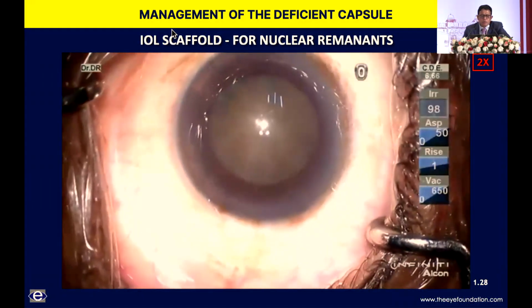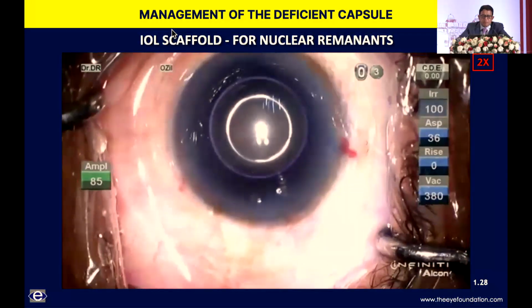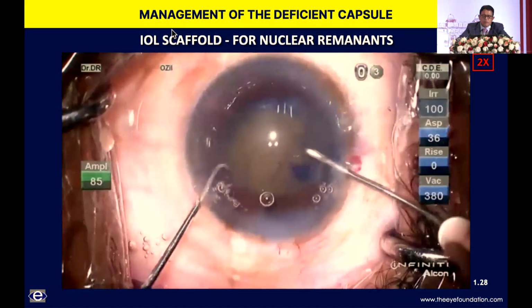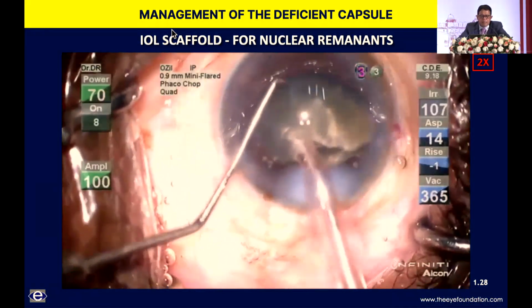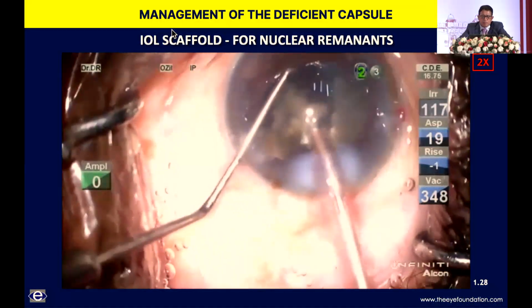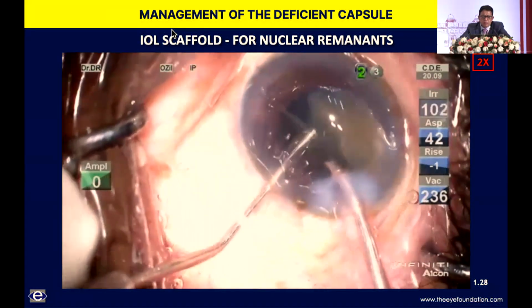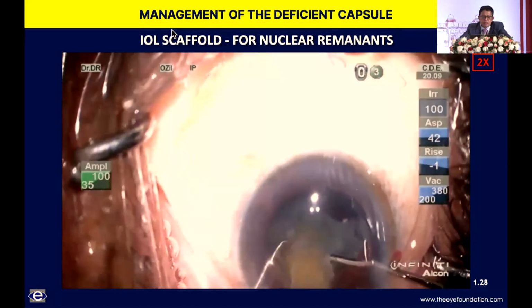And another situation, there's a fairly hard cataract. Again, everything seemed to be under control. I'm staining the capsule and going ahead with the surgery. Once the first heminucleus is removed, I find that there is a significant rent that's developing. Here again is a situation where the anterior vitreous face is not disturbed. So the first heminucleus is out, but I am going ahead with the second heminucleus. I realize that there is tilting into the vitreous face.